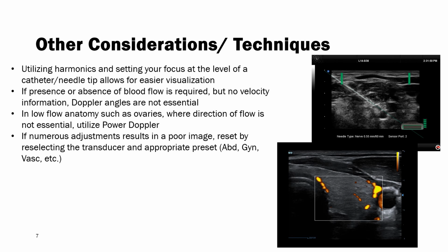If numerous adjustments are made and all of a sudden you're really unhappy with your image, one of the best things to do is stop scanning, select the same transducer that you're using, and select your preset again, and it will start you from scratch. So if you've made too many changes, you feel like you messed up your image, and you can't get back to where you wanted to be, you don't have to exit the patient. Just reselect that preset.